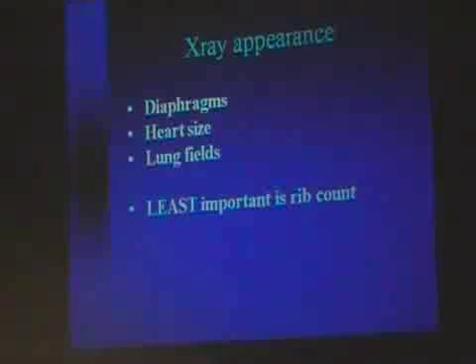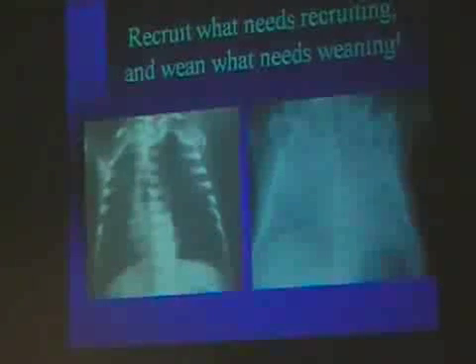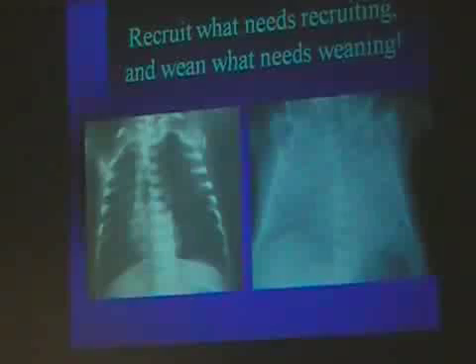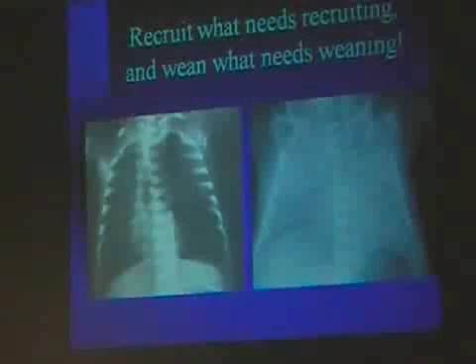And if you have a baby that really needs to be weaned, I, again, would sit your butt down at the bedside, because this is a very dangerous situation. This is a very dangerous situation there on the left. What I would do in that situation is drag up a chair, sit down, start weaning my mean, and watch my FiO2. You want to wean until your FiO2 is at a minimum. I don't know if that's going to be weaning by a mean of 10 or a mean of 2, but you have a problem there. You have a high risk for pneumothorax. You have a high risk for an IVH.